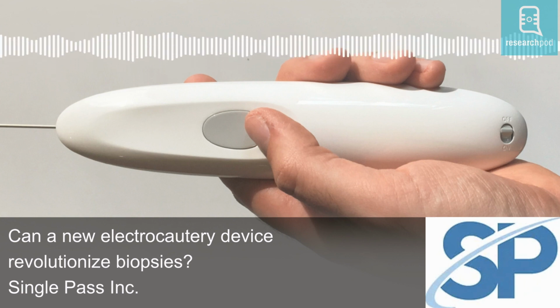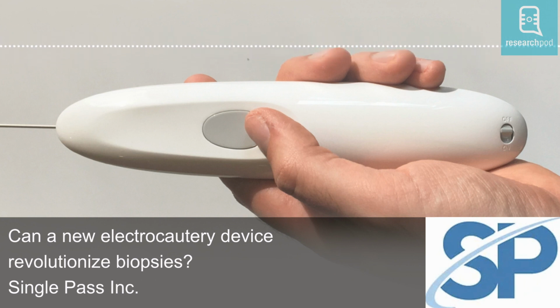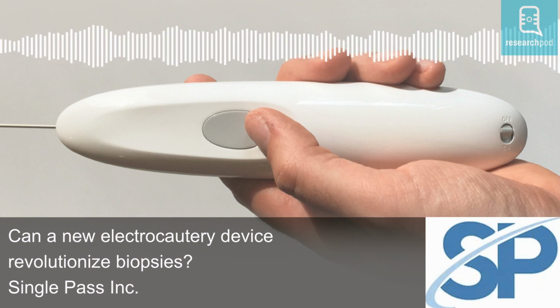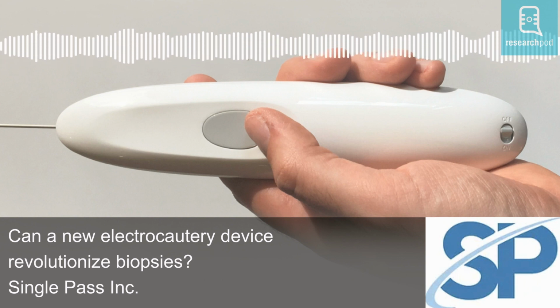Single Pass reports that their product can quickly, easily, and safely cauterize deep tissue through a guide needle to prevent bleeding. The technology was created by Dr. Peter Sonnenschein and Dr. Kevin Hirsch, who began working on the problem around 8 years ago. Peter and Kevin are both professors of radiology at the University of Arizona School of Medicine.